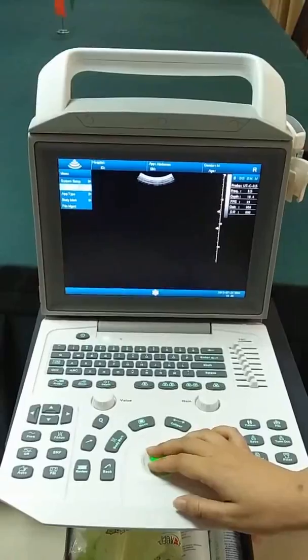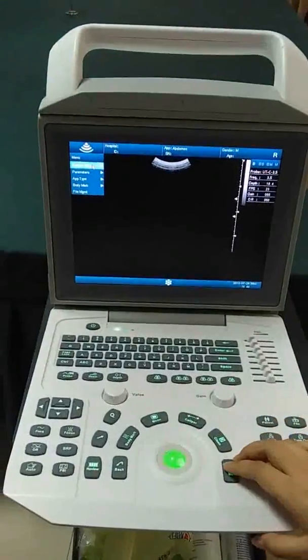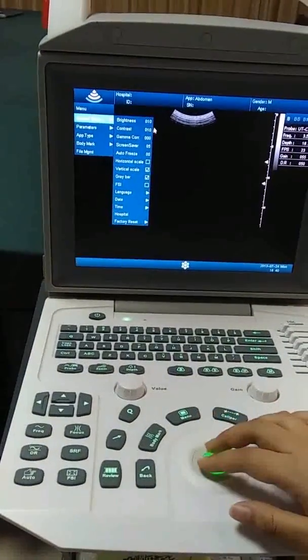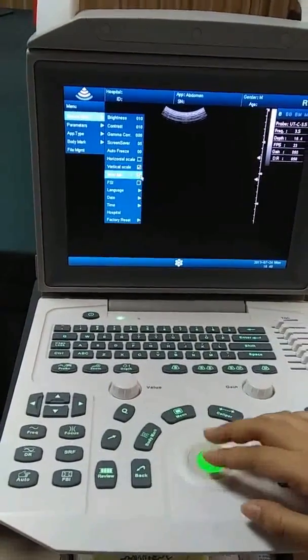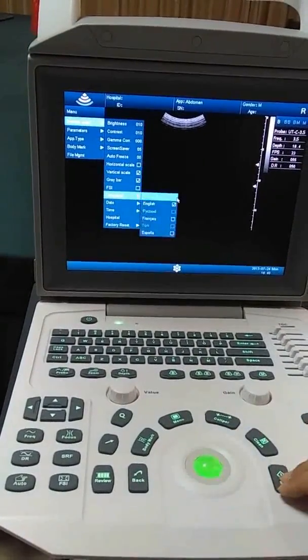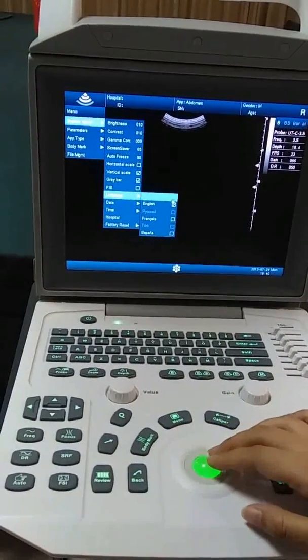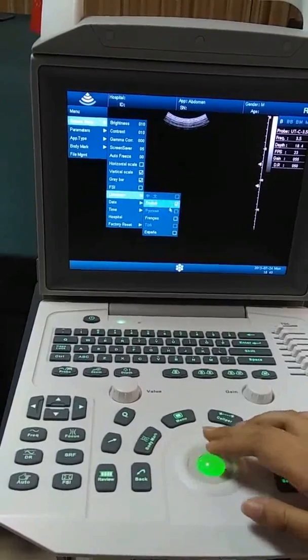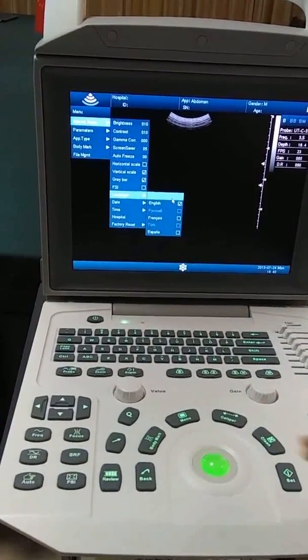Now we come to the parameters and system setup. In system setup, you can set different things. Regarding language, there are four options you can choose: English, French, Spanish, and Chinese.